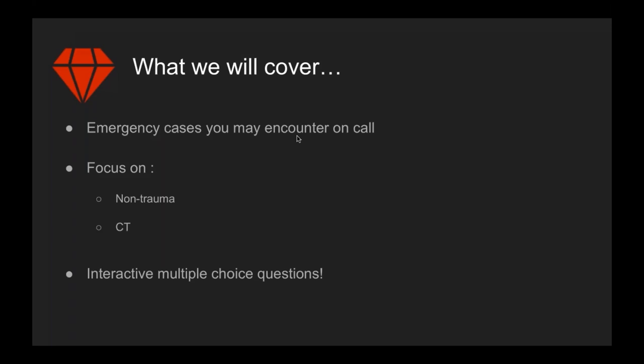Like I say, we're going to look at some emergency cases that you might encounter on call, and I've focused this on non-traumatic cases and also CT, because when you're on call, you're going to face all sorts of things, CT, MRI, ultrasound, but we only have about 45 minutes, so we'll do CT and non-traumatic cases. This is really geared towards people who are going to start their on-call soon, because we know that a lot of our jobs are changing at the moment, but the on-calls will always remain, and the same kind of emergency cases should be coming through. And like I say, we've got some multiple choice questions as well.